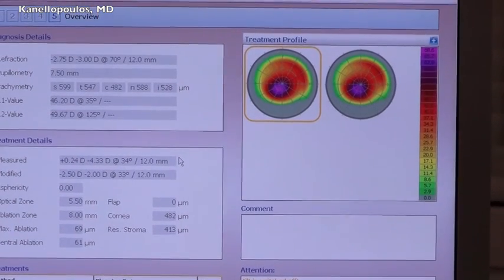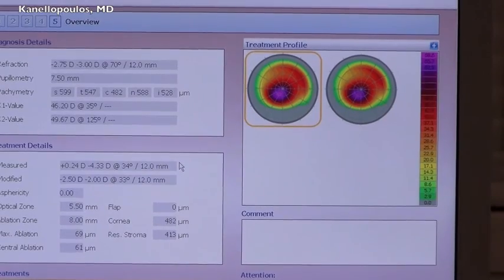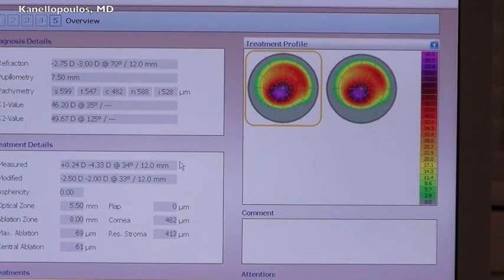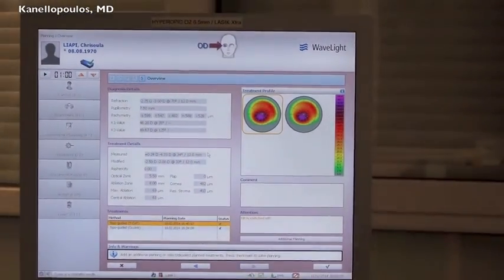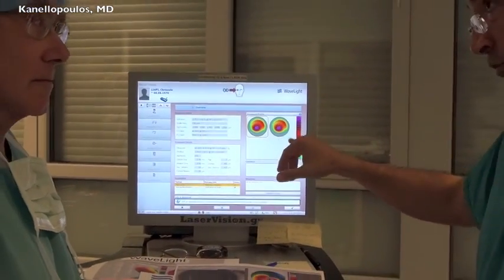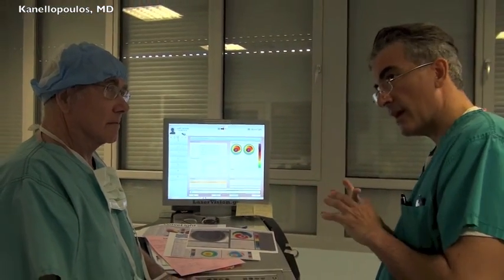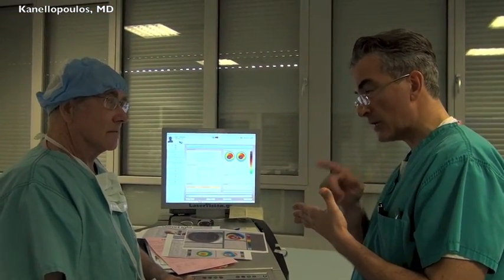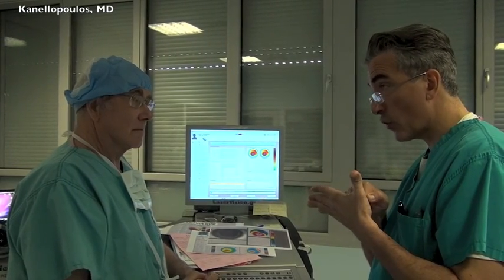It gets tricky when they're different, and then you don't know which is right. Then you have to maybe test the patient even more. Then we involve more topographies. We work with the Cassini topography, which is a multicolor spot reflection topography, which is more accurate in the center compared to the placido disc. We involve pentacam, actually OCT definition of the thinnest part of the cornea.